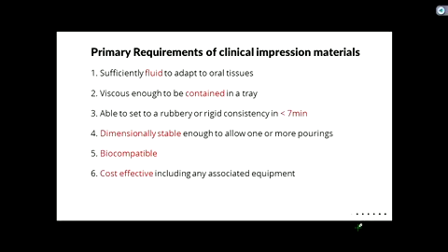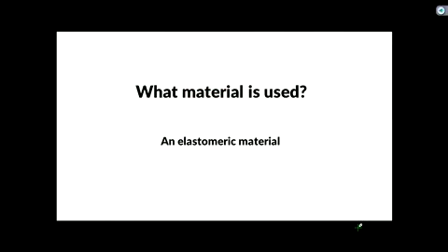It's got to be biocompatible. Obviously, you don't want to harm the patient anyway; it's got to be compatible with their oral tissue. And at some point, it's got to be somewhat cost-effective. Although, we learned at school pricing, each one of those cartridges is about $10 to us. So let's pretend you have a $10 bill on one of those cartridges, just to visualize how much it costs, whereas alginate is maybe like a dime or something.